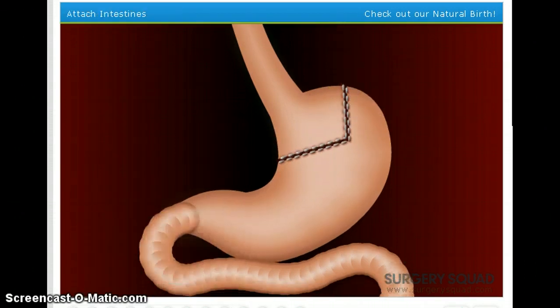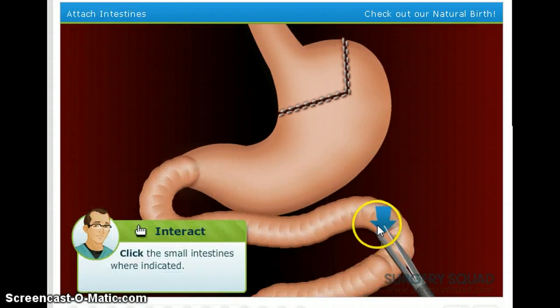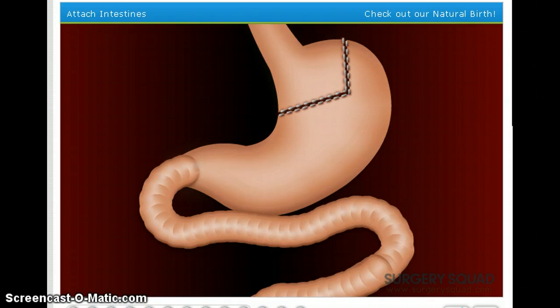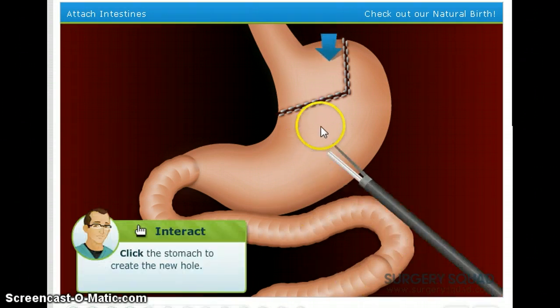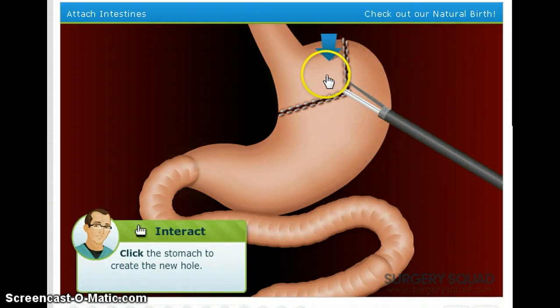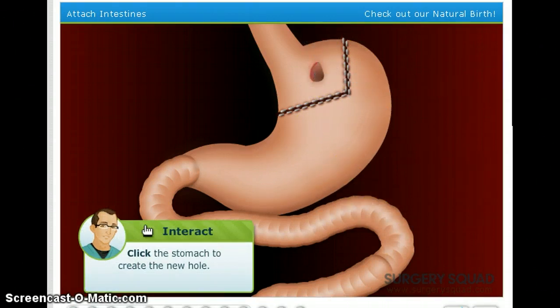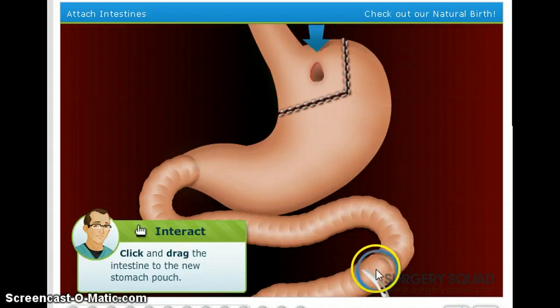Staple. We'll now separate the small intestine from the old stomach, about 2 feet down. Staple, or cutty. The lower part of the intestine will be connected to the new, smaller stomach, with a half-inch opening between the stomach and the intestine. It's kind of like rerouting traffic on the 405. Use the electrocautery device to create a half-inch opening where indicated in the new stomach pouch. Sizzle. Now, drag the loose end of the intestine to the new stomach pouch to attach it.